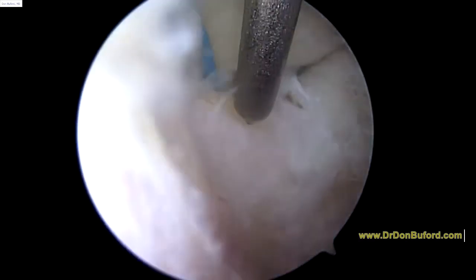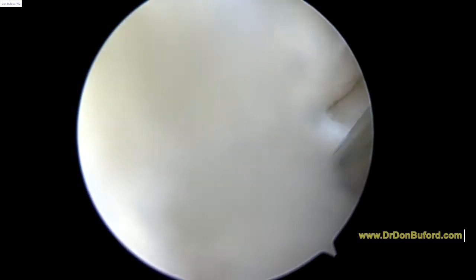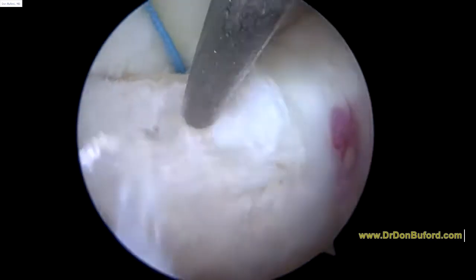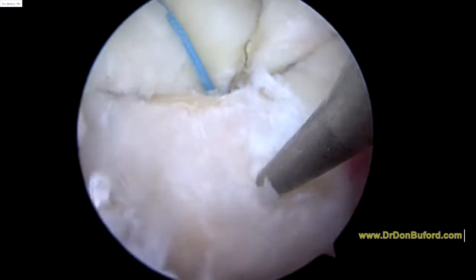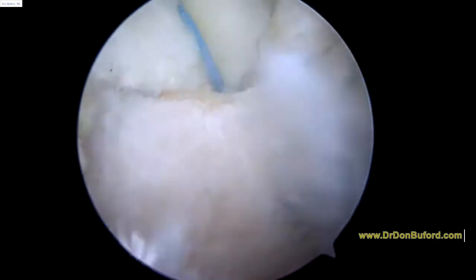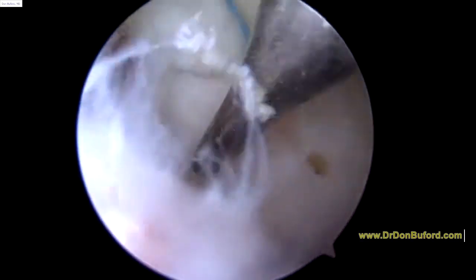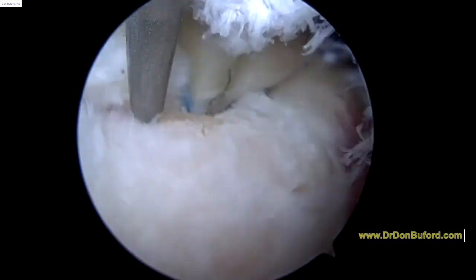Just trying to get to where I can show you a good image of it. So, hold the camera here for a minute. Can you come down here for me and just lift me off straight up, please? Yeah, that's a pretty good shot there. So we're going to make a little hole in the bone down here. Nope, a little more. So there's one. Rotate towards me. So rotate, yeah. We'll make another one here.